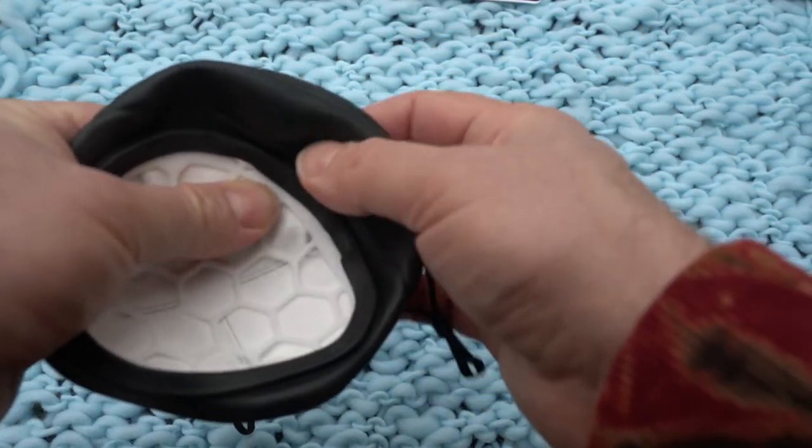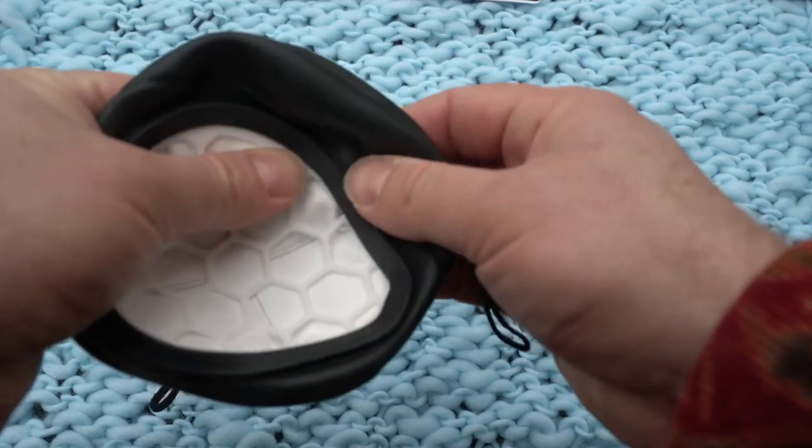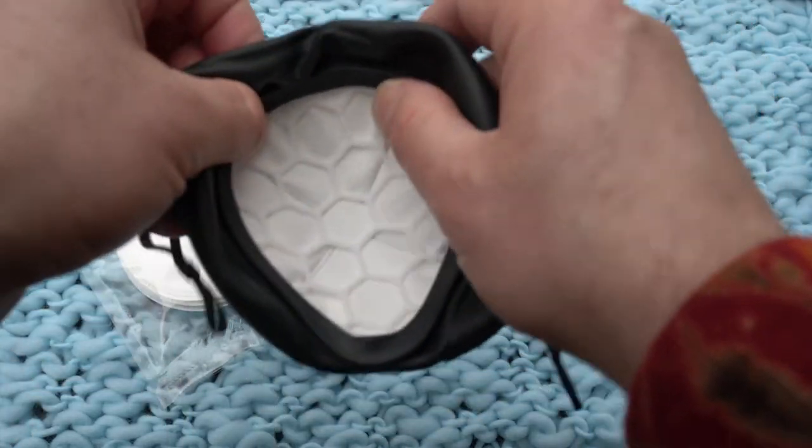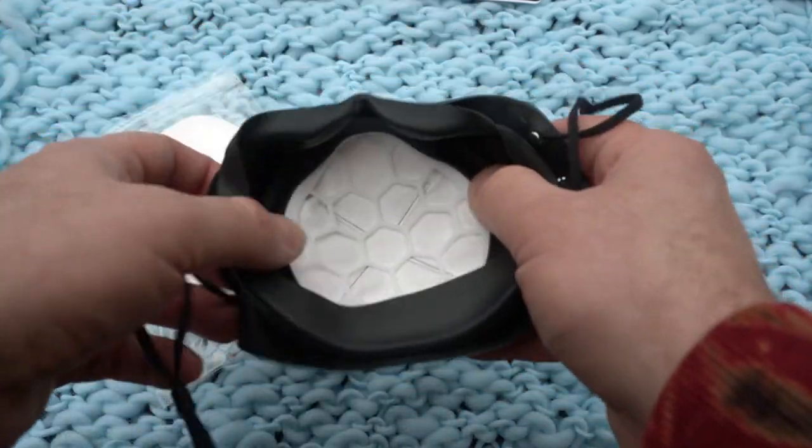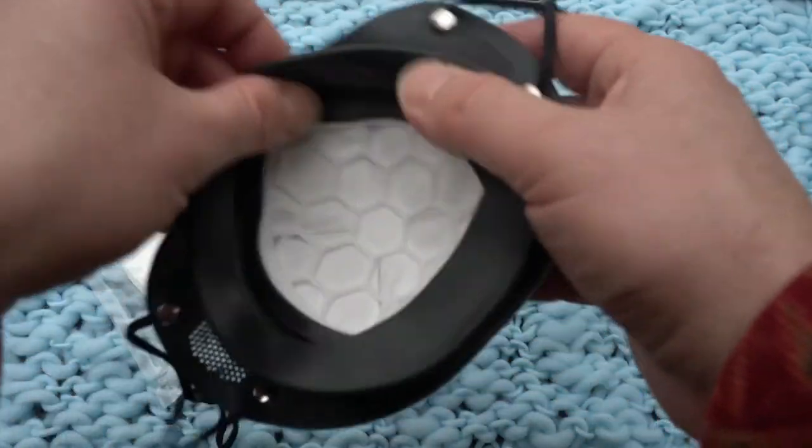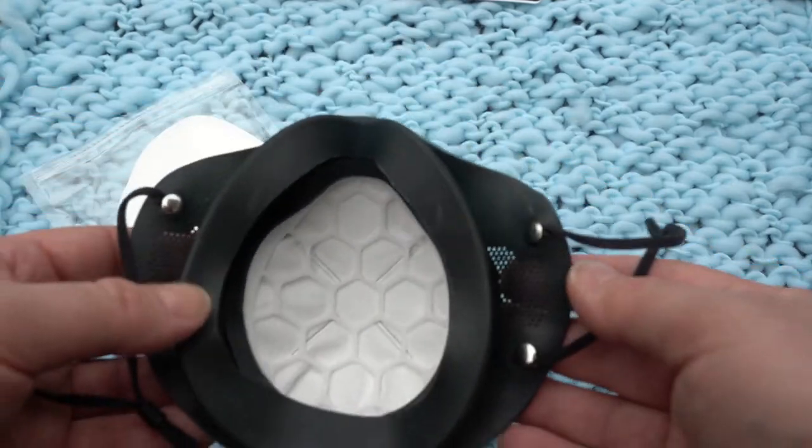You can see I'm just putting that silicone seal around the filter and filter frame. Now I'm just right-siding it out. And you're done.